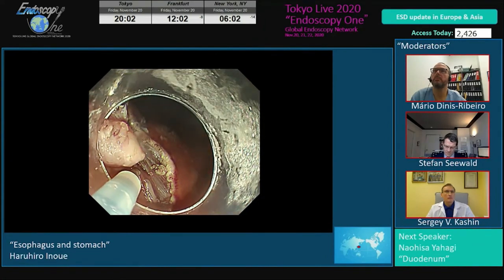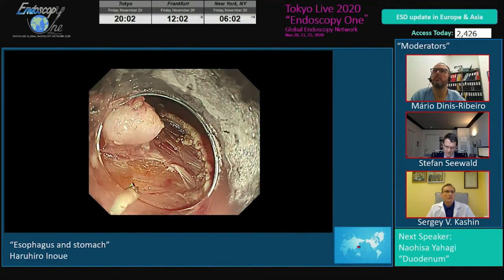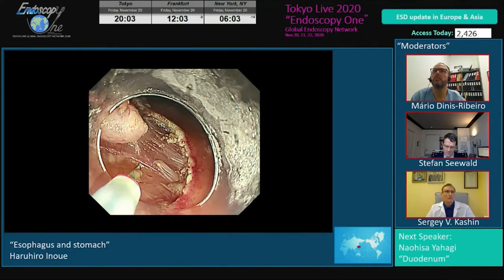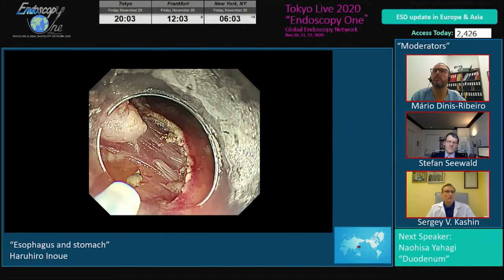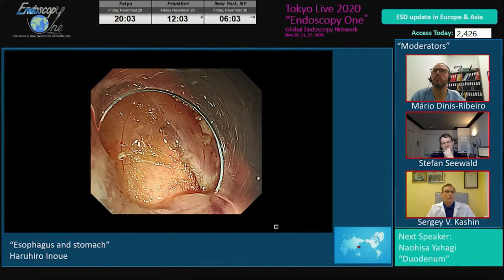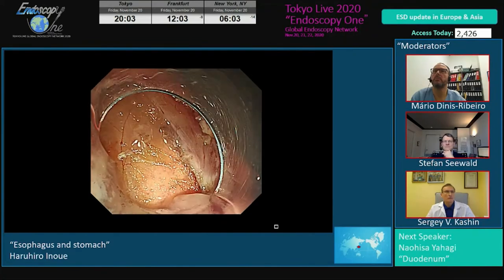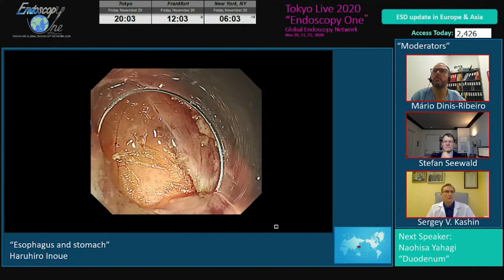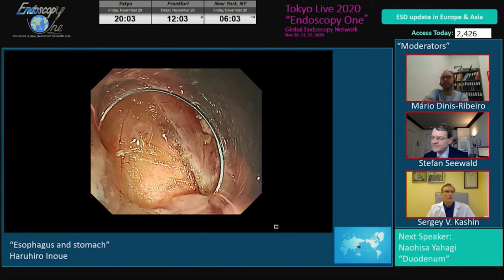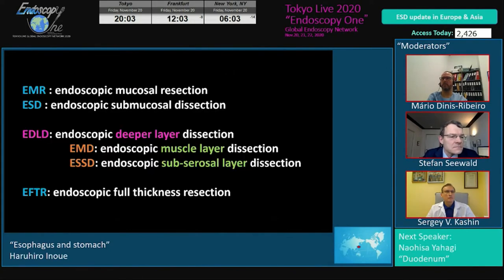Then now we dissect the muscle layer in order not to make an injury to the capsule of the tumor because this is GIST. Now we are dissecting the muscle layer. Finally, we can preserve the peritoneum. Behind the peritoneum, you can see the surface of the pancreas, because this tumor is located at the posterior wall of the stomach. After that, we close the mucosal defect using clips.